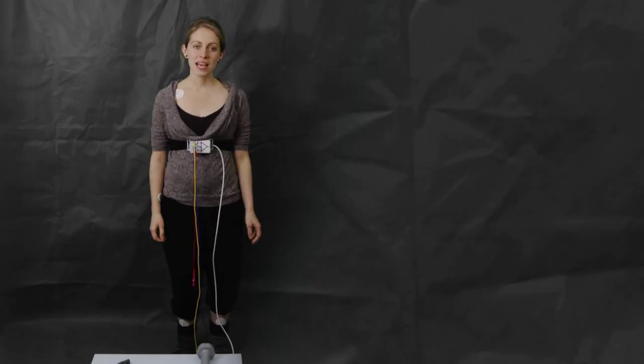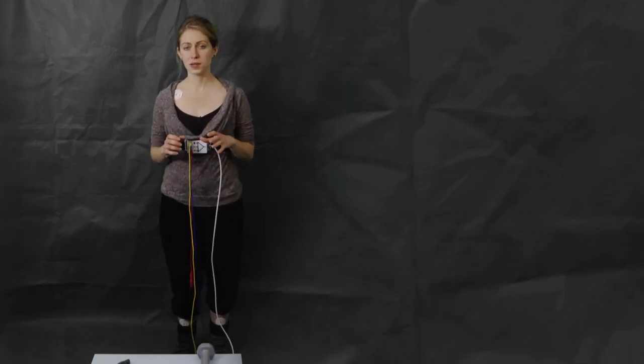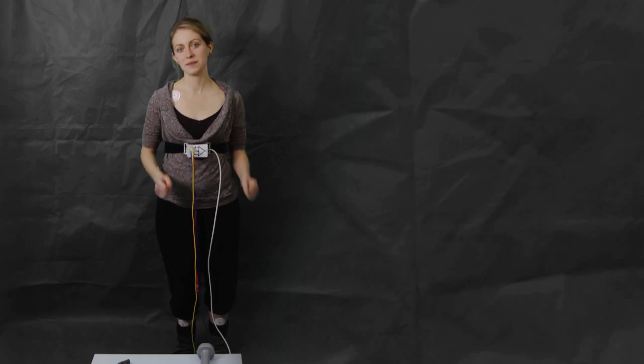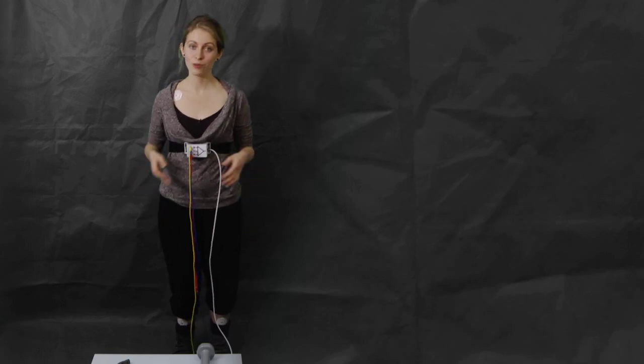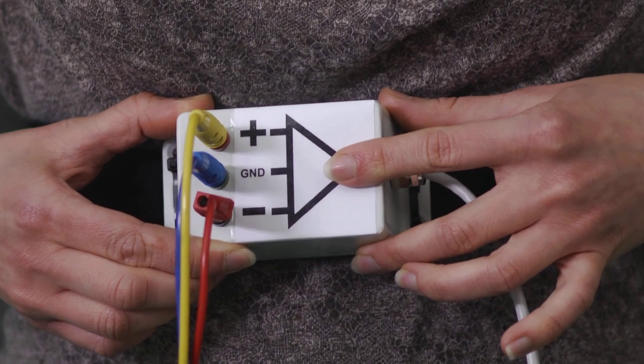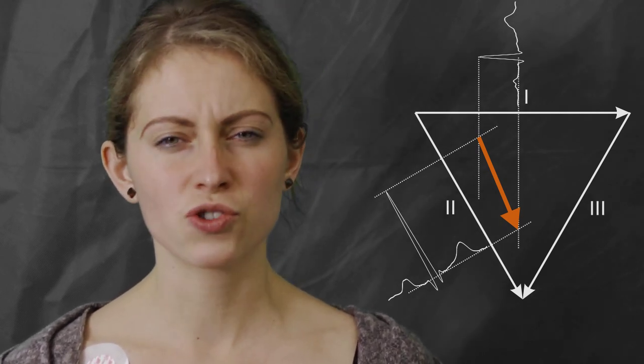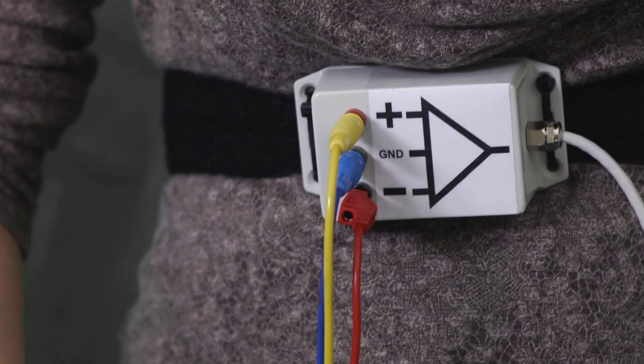Hi there. So in this clip, we are going to take a look at the different artifacts arising when measuring ECG and a way to minimize them. And we shall do this again with our differential amplifier. So I am going to use Einthoven 2 today because the angle of the electrical field of my heart is 65 degrees. And this gives us a very strong signal in this lead.